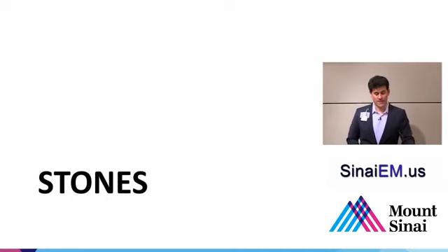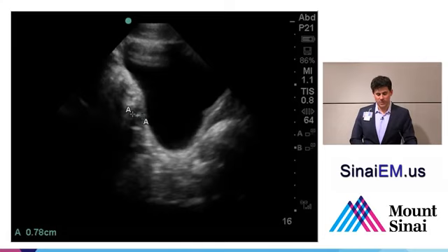So we've got hydronephrosis, and the next thing we can talk about are stones briefly. We're not really looking for stones per se, but sometimes you can see them on ultrasound. One of the more common areas that a stone will get caught is at the UVJ, or the ureteral vesicular junction. So we're in a sagittal orientation here, and this is towards the patient's head, this is towards their feet. So this is really sort of posterior here, and we see a stone right there measuring almost 8 millimeters. And it's hyperechoic, and it shadows a little bit, and it's right in the right spot. So that's pretty suspicious. In this particular patient, it was associated with hydronephrosis on the right side. So it really was very consistent with the diagnosis of renal colic.